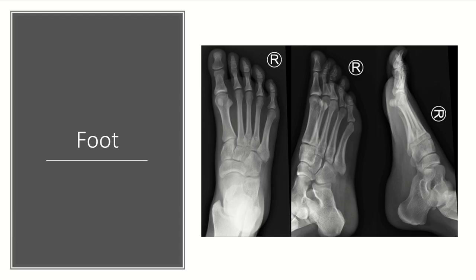The foot series is typically three views: a PA, an oblique, and a lateral. On the PA view, we want to see the medial aspect of the second metatarsal in line with the medial aspect of the middle cuneiform. On the oblique, we want to see the medial aspect of the cuboid in line with the medial aspect of the fourth metatarsal. On the lateral, we want to see the dorsal aspect of the metatarsals in line with the dorsal aspect of the tarsal bones.